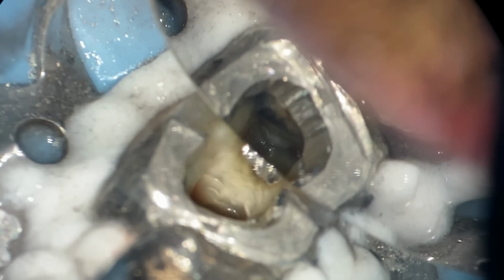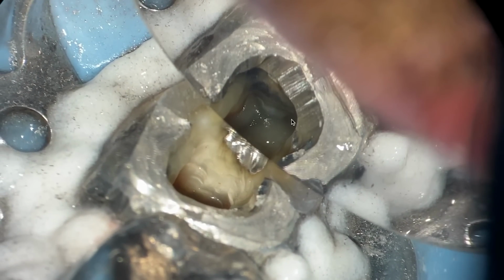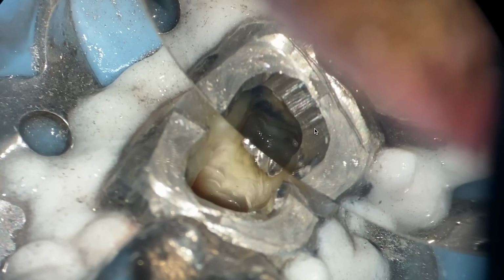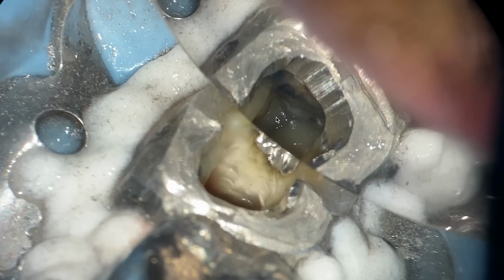So how do you get into that? Well, I can tell you with great difficulty. Look at that. There we go. So let's zoom in right there. There we go. So this is calcification, and then there's some sclerosed pulp tissue, bottom of the floor, mesiolingual. Let's keep going here, Ash. So you're going to have a difficult time. I'm going to have a difficult time, and I have had a difficult time.